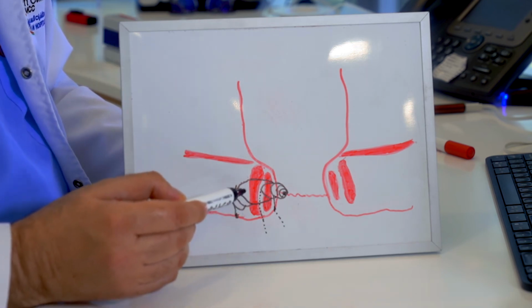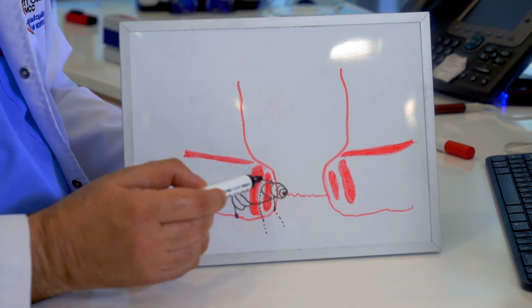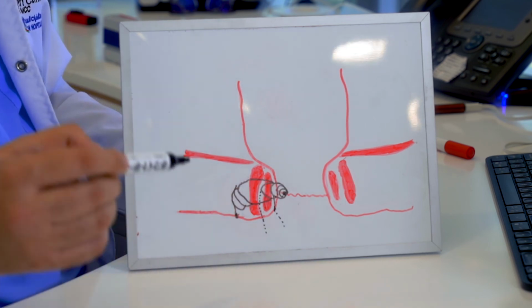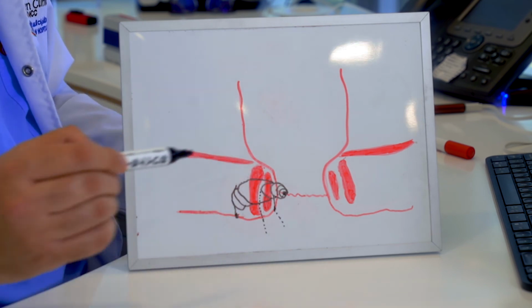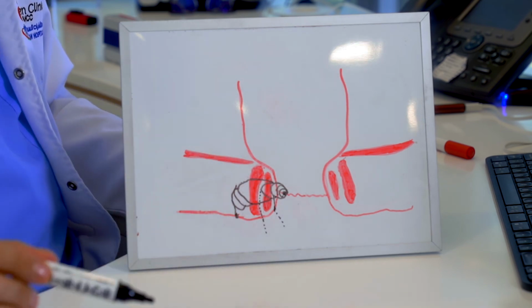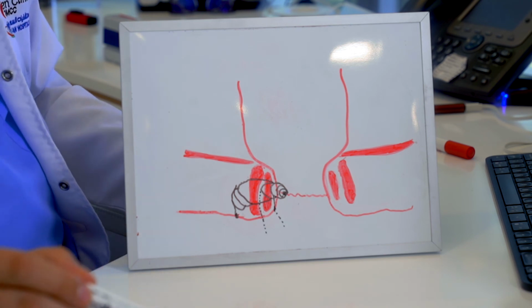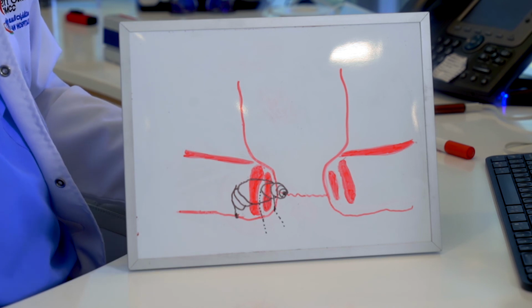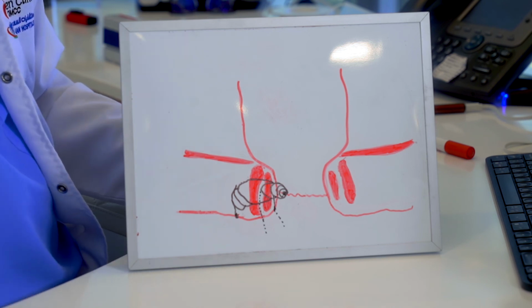because we can do it without cutting any of the skin or the muscles, using a laser fiber that will allow us to coagulate this fistula and close the internal opening by a special technique that we designed several years ago, and it works very well in this condition. This will allow us to do these cases under local anesthesia in a few minutes with a very high success rate.